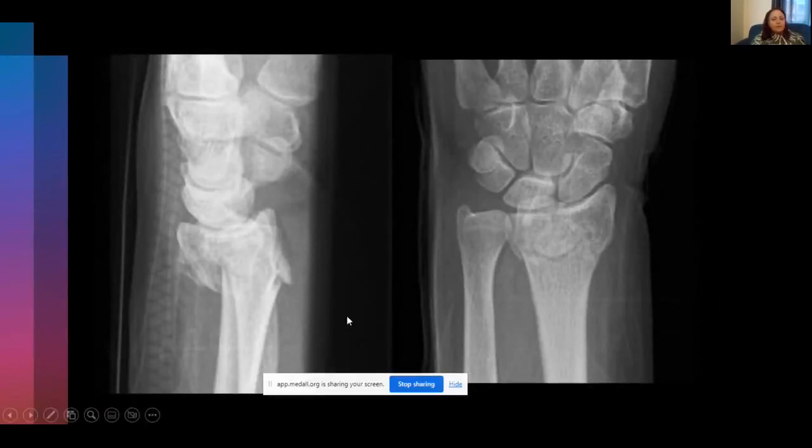That's an example of the distal radial fracture on the AP view. It doesn't look angulated on the AP view, but look at the lateral view. That's the distal fragment, and that's the proximal fragment. So the distal fragment is relatively posteriorly or dorsally angulated. That's a dorsal angulation. That's a famous fracture, impacted dorsal angulation, a fracture of the distal radius. It's called the Colles' fracture.